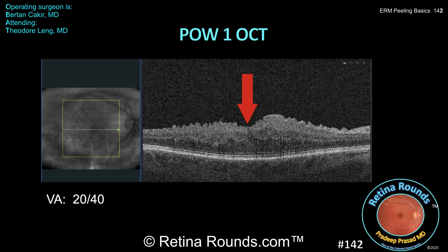Here's the patient at post-operative week one. You can already see normalization of the foveal contour and resolution of the ectopic inner foveal layers. The foveal outer nuclear layer still looks elongated, but it's early in the post-operative course and there's certainly more opportunity for anatomic normalization in the coming months. Notably, this patient's vision has already improved to 20/40 and the metamorphopsia has improved as well.